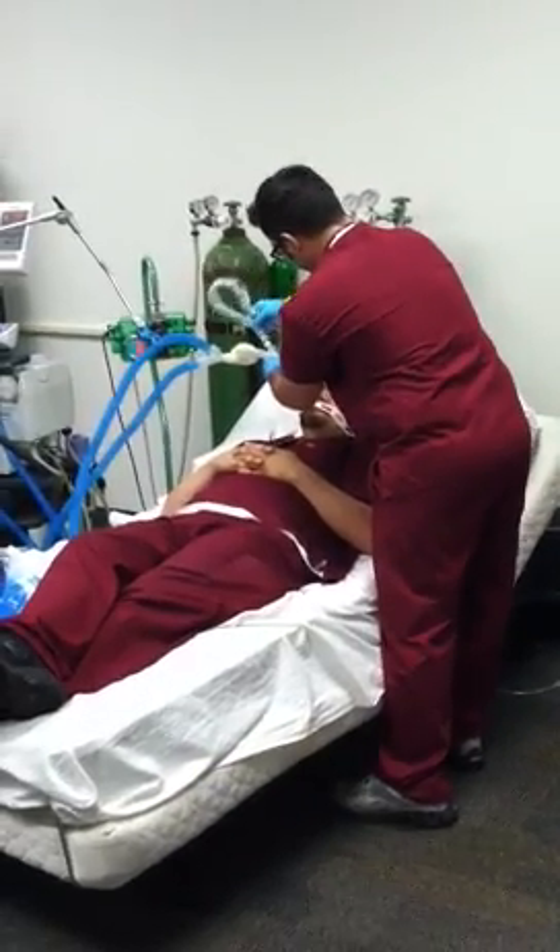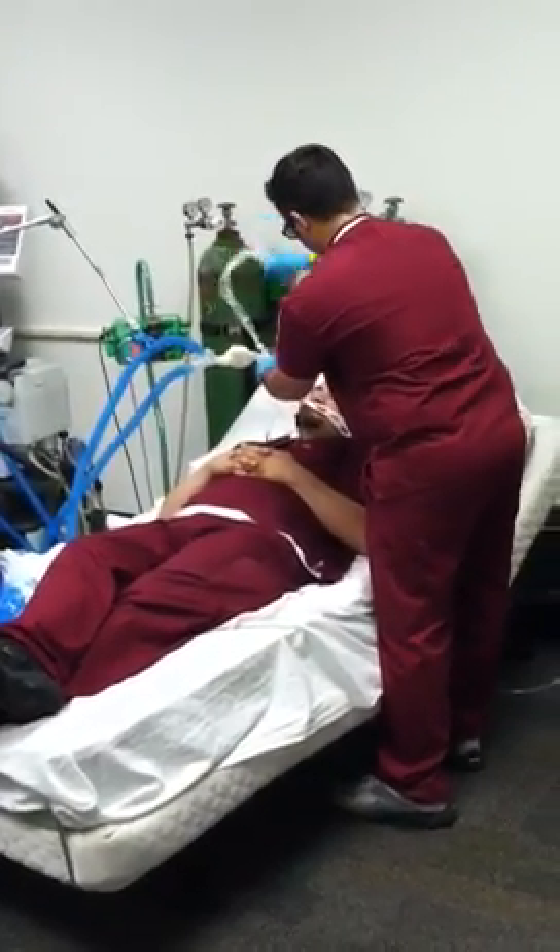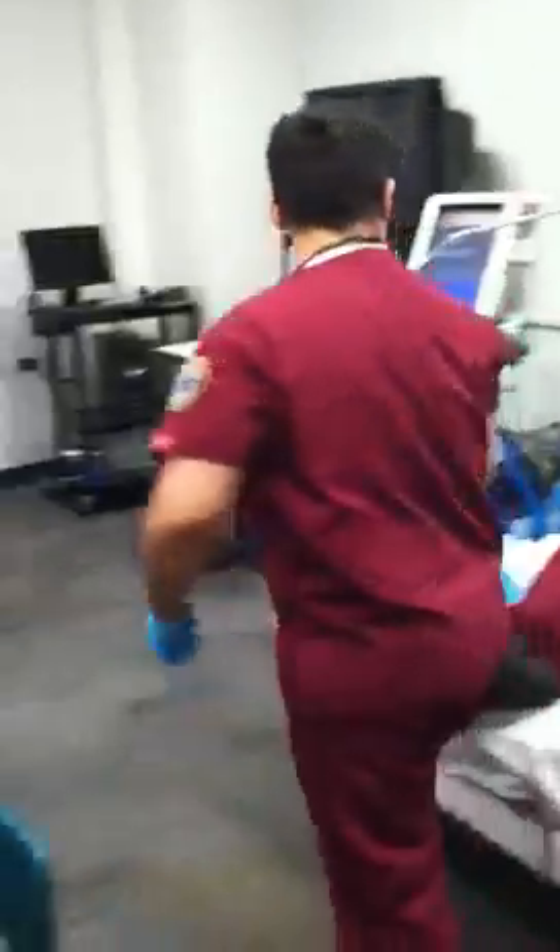He's going to suction the patient if indicated, and empty condensate — empty water from the tubes if there's any rain out.